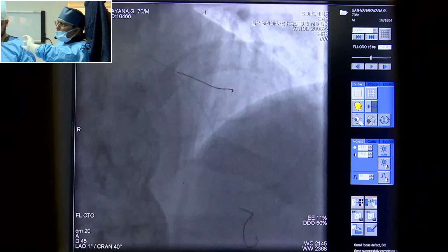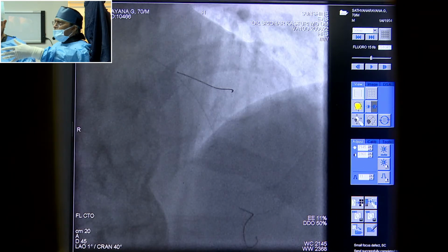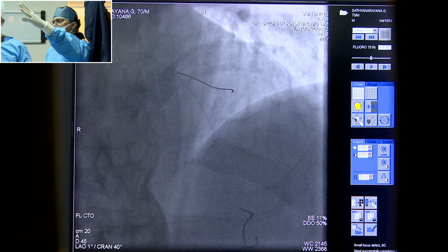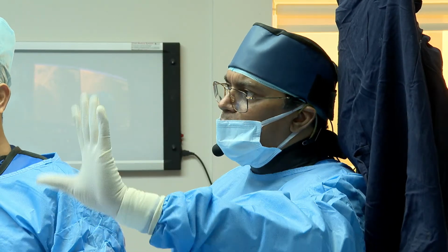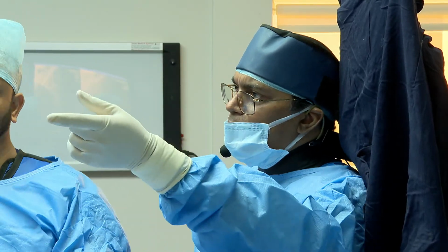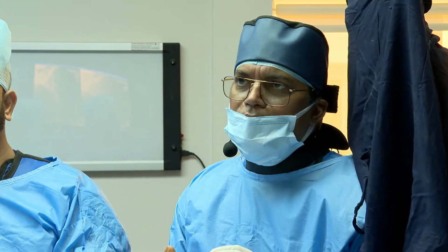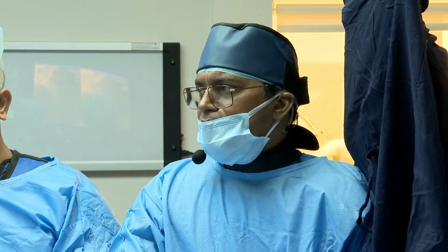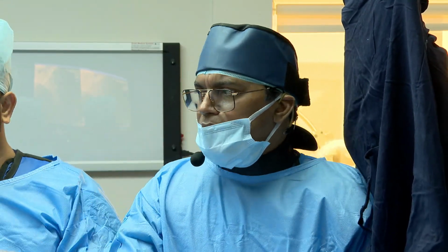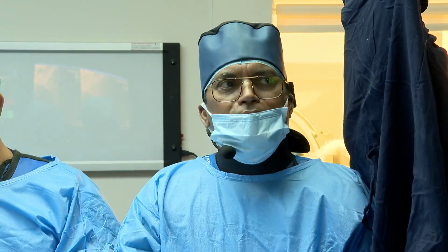Here the cutting balloon moved proximally. If you go proximally, you have already injured the endothelium, then it has to be covered. Ideally, just beyond the diagonal only, we should dilate and put the 33 mm stent. Here we are adding another 5 mm, which can be avoided. That is the reason when you use OCT or imaging, use it to the maximum extent and utilize how it helps. You can minimize the number of stents and the length of the stent.